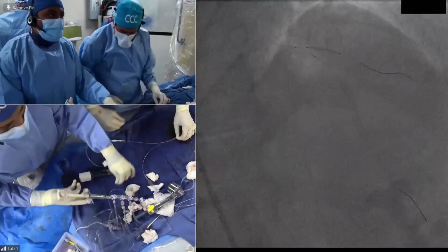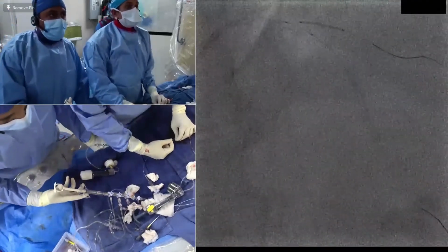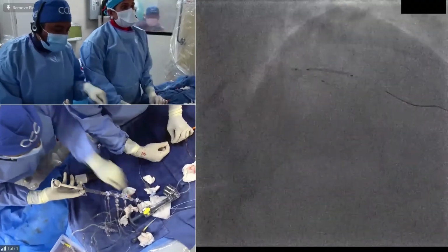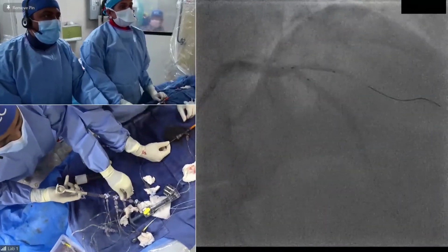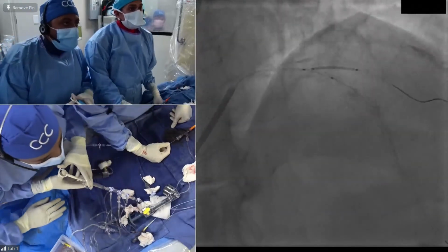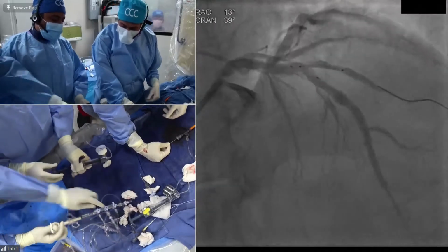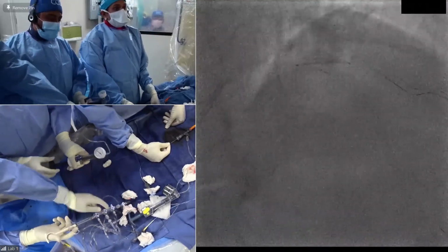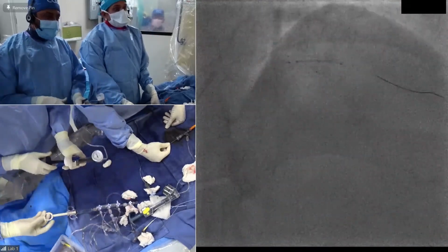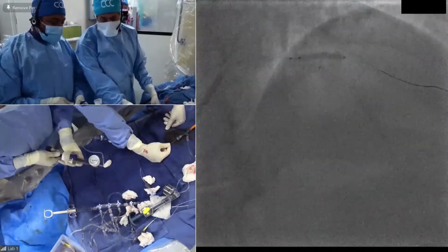Exactly. So now you see there, we want a side branch stent to come into the main vessel. All right, great. Let's do a little test. A millimeter, a little bit of the strut in the LAD. Everybody okay? Perfect. Right there and there. Inject. Don't move it. Good. Go up with the side branch stent. We're going up with the stent at a high atmosphere. Good, 14. Yeah, we are at 14.